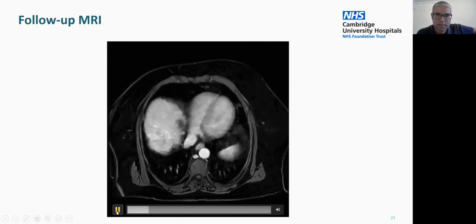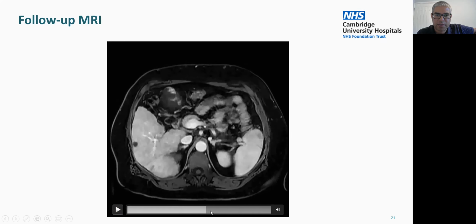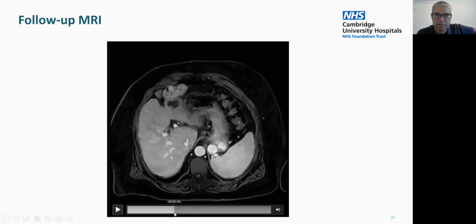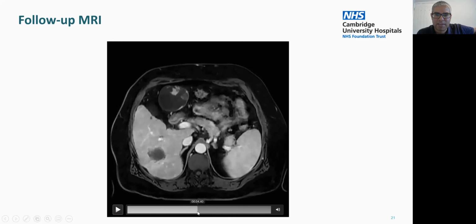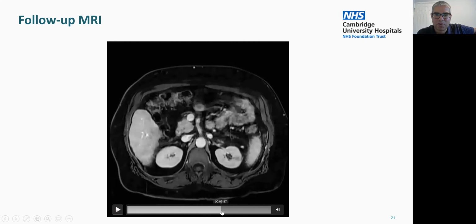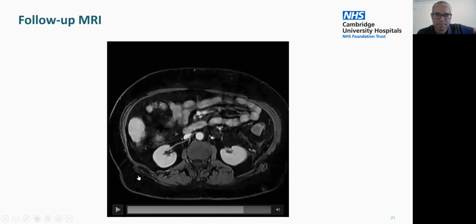So this patient has had a 2-month follow-up scan, which so far looks very good. We can see the ablation cavity there. We're not seeing any evidence of local recurrence at this very early stage, although naturally I was watching the top end very carefully to check that there was no obvious recurrence at that cranial-most margin.